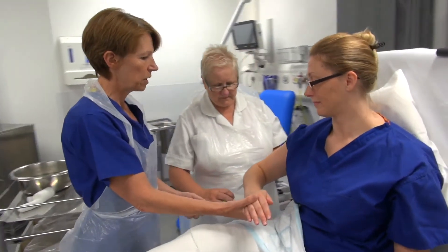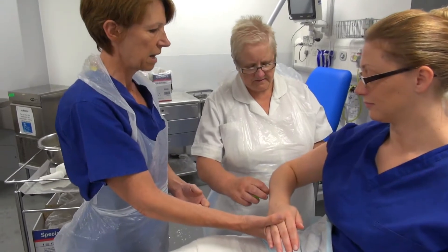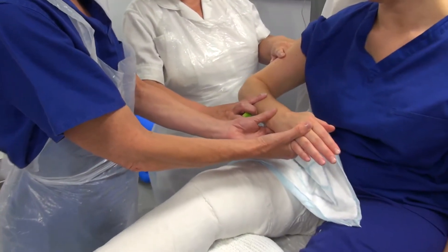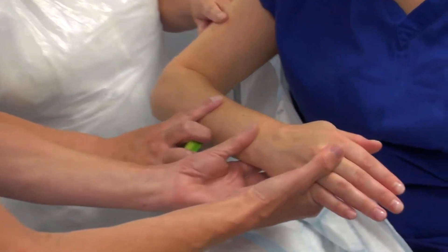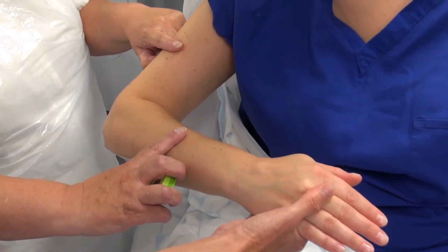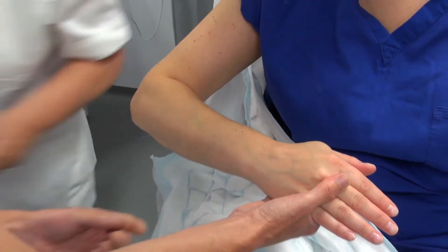Pam is just going to measure the size of the cast here, and I need to hold the arm in position with the arm at 90 degrees at the elbow. Mid shaft humerus to mid shaft radius is where Pam is taking her measurements from.